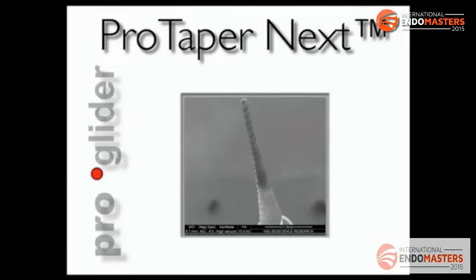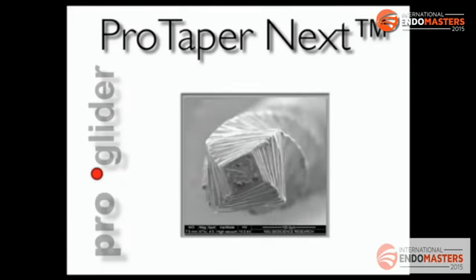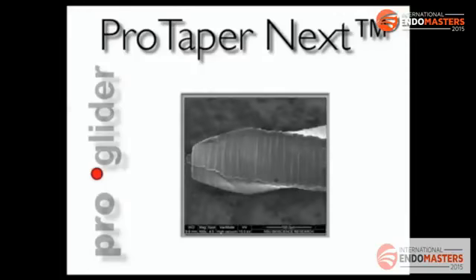Here we have a few pictures from the SEM microscope. We can see the tip, we can see the square cross section. Here the blades also.